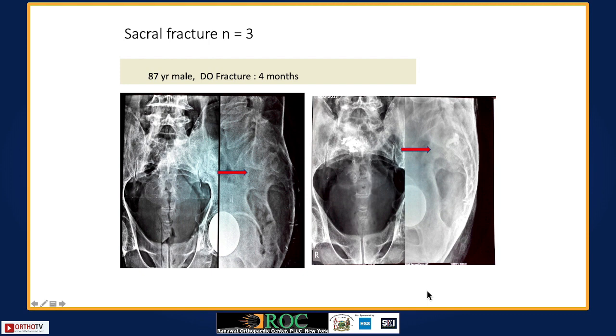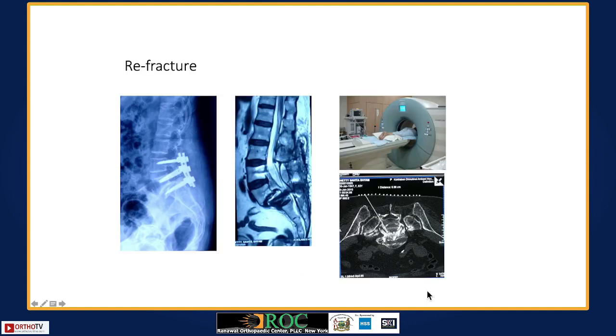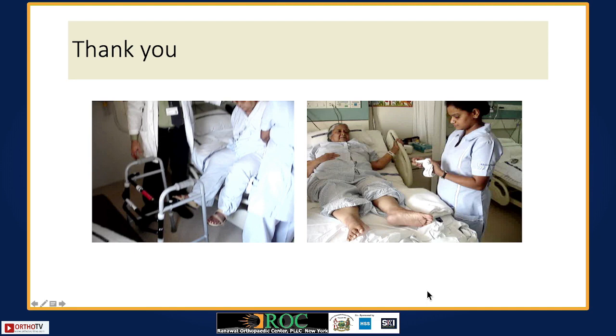That means sacrum. Sacrum is a very, very interesting part because these patients are highly morbid and they are not able to turn and they tend to deteriorate. There is a very high incidence of mortality if the patient has a sacral osteoporotic fracture. And sacroplasty is one simple procedure which you can do under CT scan guidance. You can have a sacral fracture adjacent to your screw, which you can stabilize using a cement again. And these patients are extremely grateful because their morbidity reduces significantly.